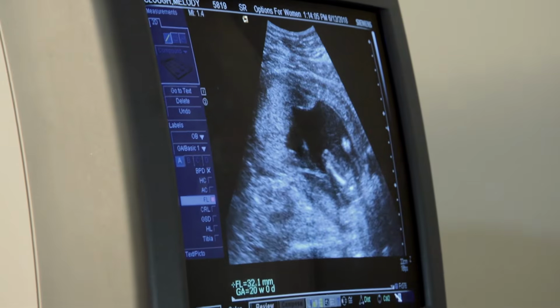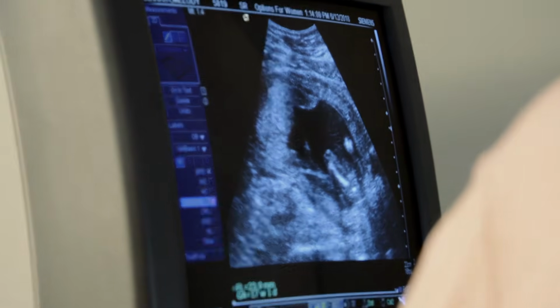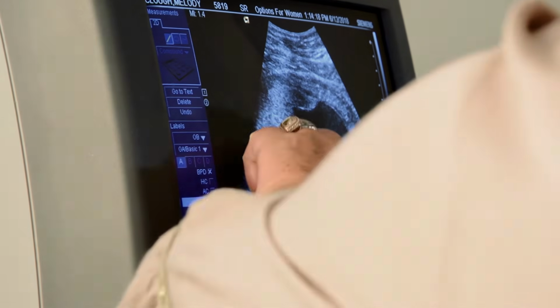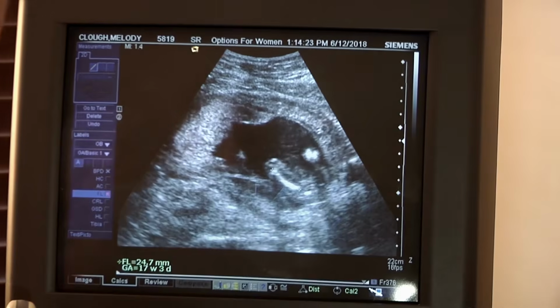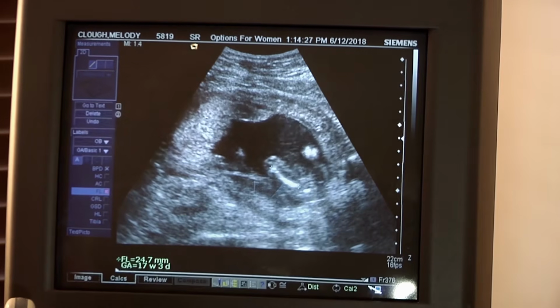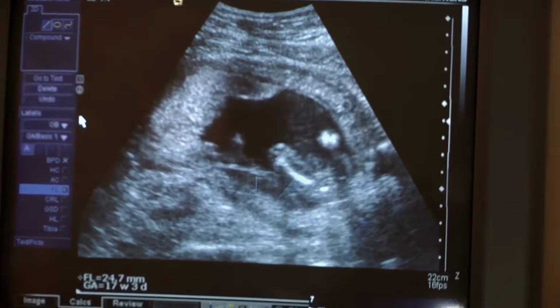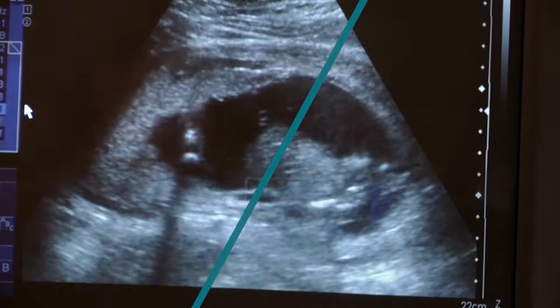So I need one there. No, that's the epiphysis, so you don't want to go there, you want to go there. Perfect. 17 weeks, 1 day. Let me see here. I'm going to make sure you get right to the edge. Yep. Okay. I got 18 on mine, but we'll take it, and then we'll get the average or get the longest. Okay. You got that pretty good. That was awesome. Unfreeze? Okay, who's next?